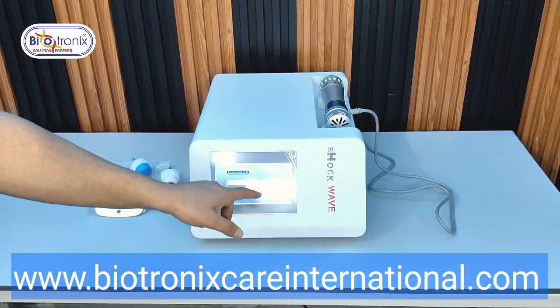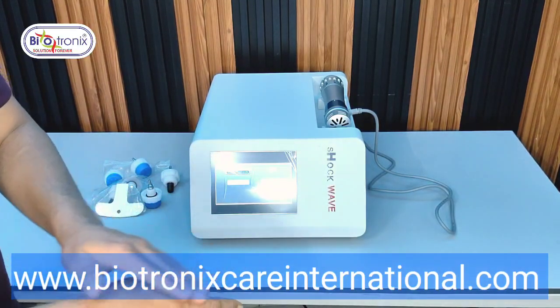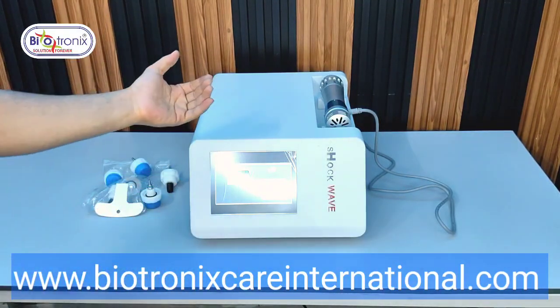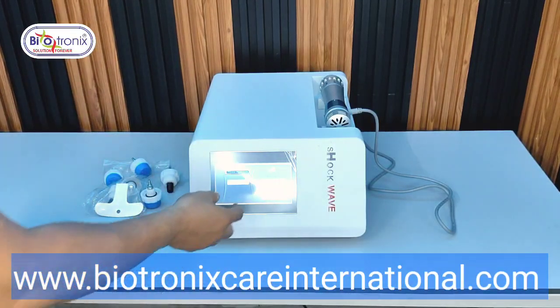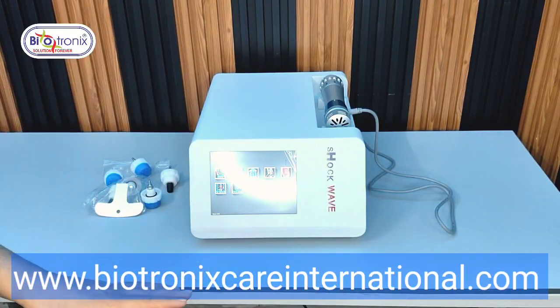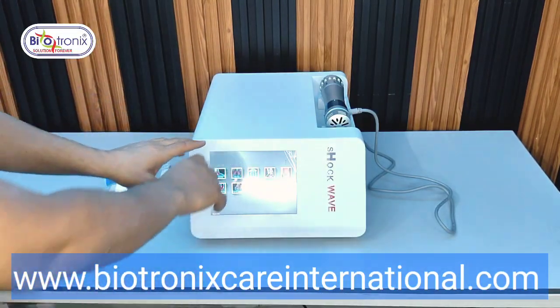You can see this is password protected. By default, the password is six times 0. But if you want it modified, you can change it and give the password only to those attendants who can operate the device and are authorized. So now I am putting the default password, 0, 0, 0, 0, 0, 0. Six times 0. As I put it, I have entered the interface.